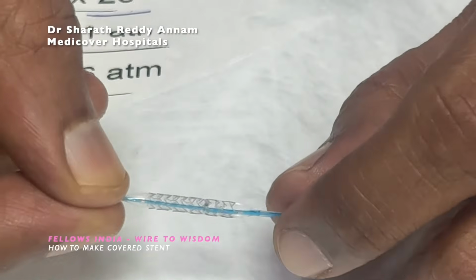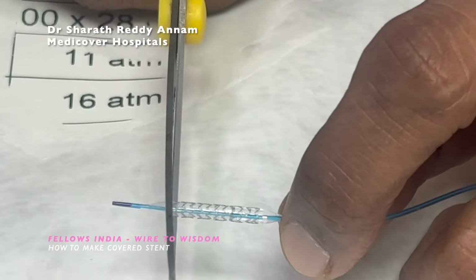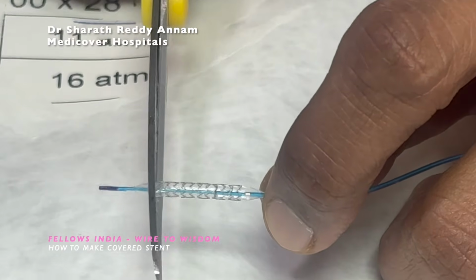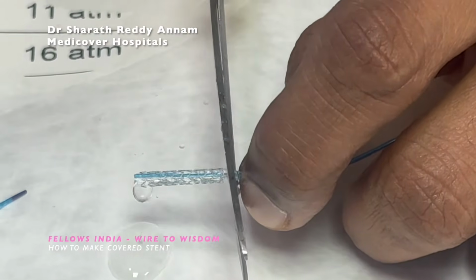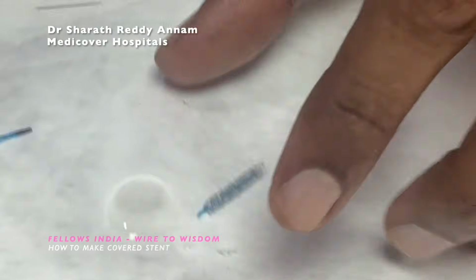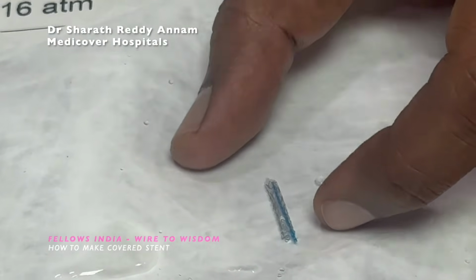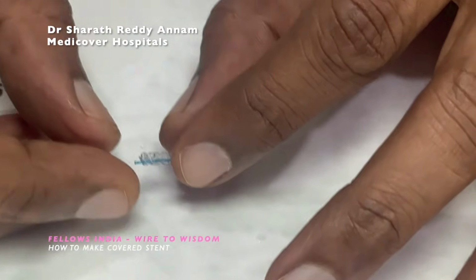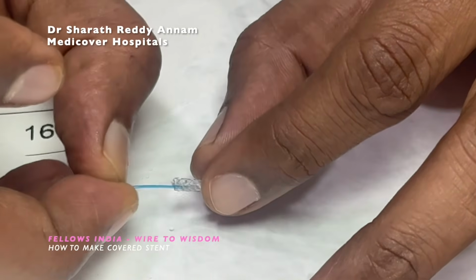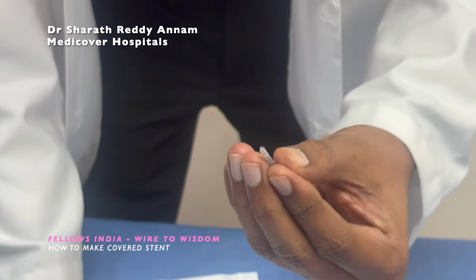So what we are doing now is cutting this balloon on either side of the stent. We cut this balloon on either side of the stent. Now we can remove the central lumen. So the central lumen is removed. Now you have the balloon along with the stent here.